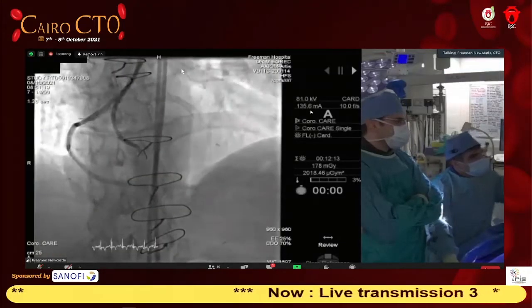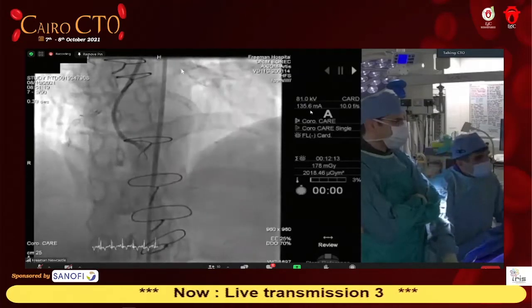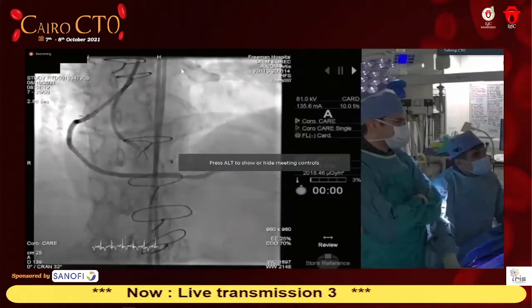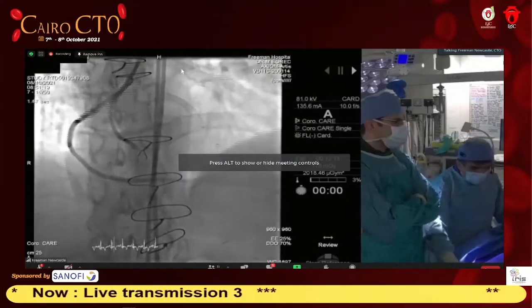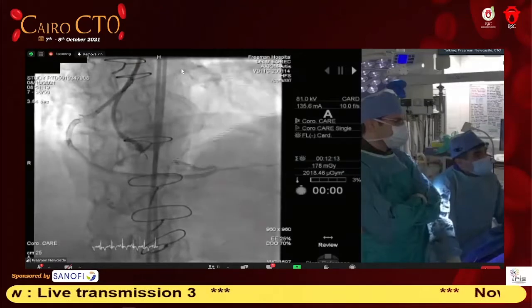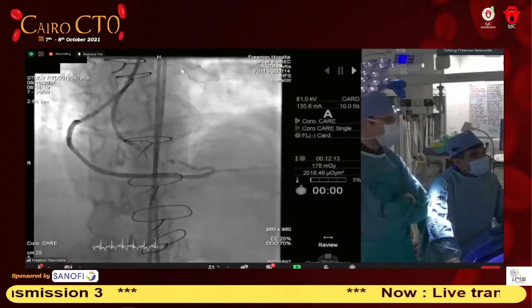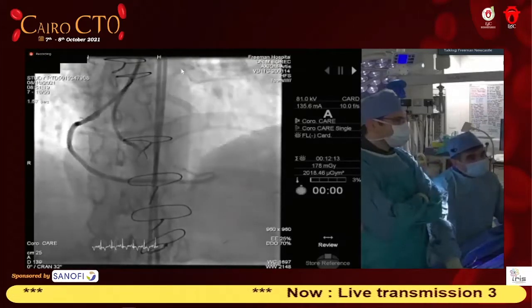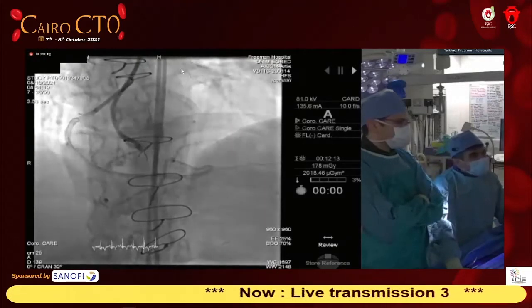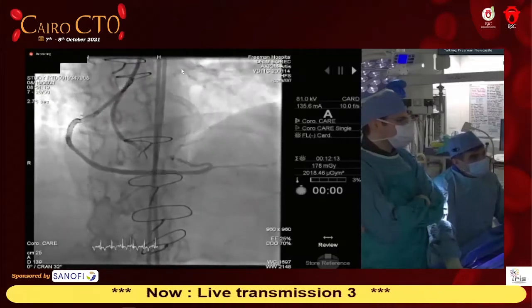There are some arguments about medical treatment, so can you bear with us for that, okay? Sure. No, absolutely. Yeah, absolutely. I mean, it's a valid thing. But as I said, to my mind, this is a young lady, 55, normal LV. She's had 2 previous MI, and she presented with a problem with the vein graft. To my mind, I thought a preemptive action, opening the native and sorting this out, is much better than waiting for something else to happen.